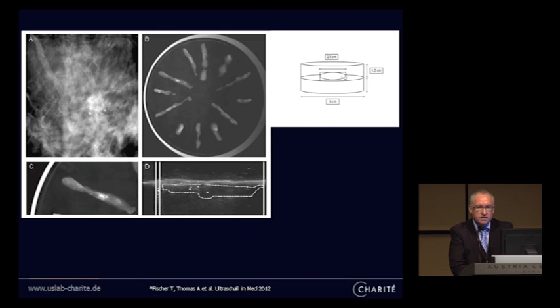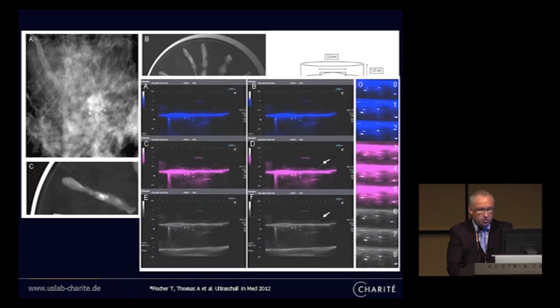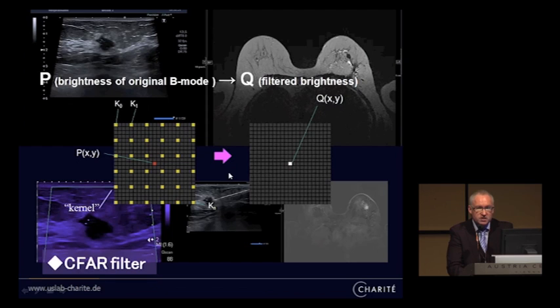What about microcalcification? It works also very nicely for microcalcification scanning. You see here this is an experimental setting of small biopsies and the correlation to the vacuum biopsy or digital mammography, and we see clustered microcalcification in different mappings. And we use this, of course, also for the patient situation.